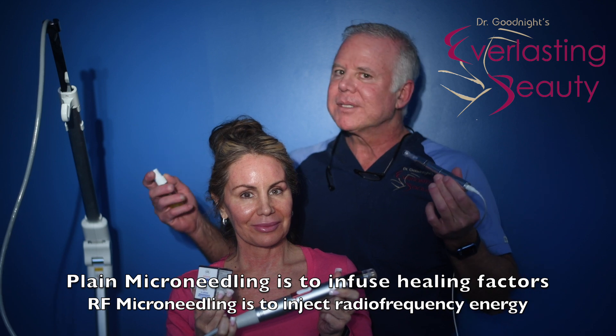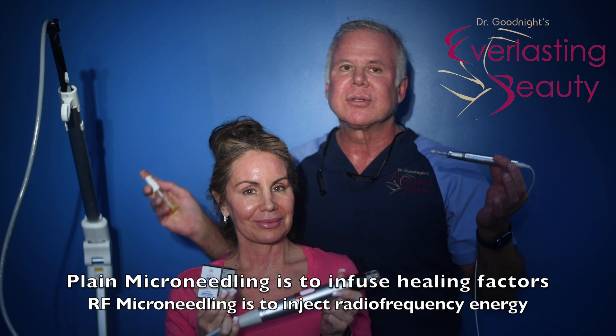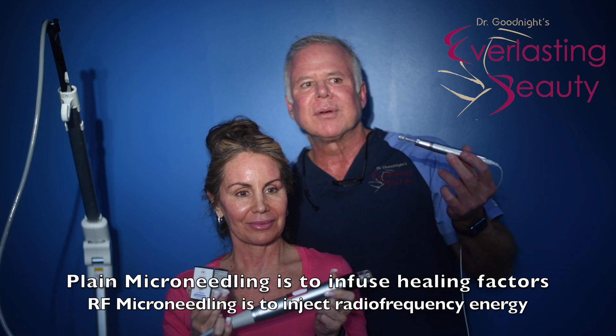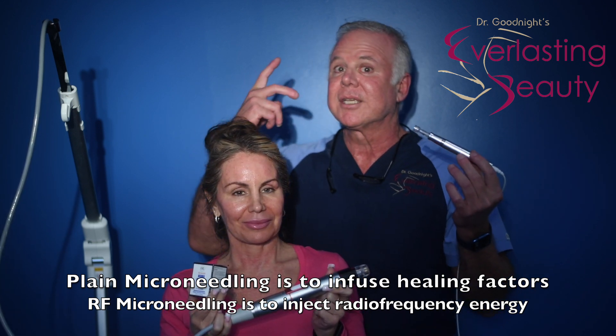The whole purpose of the needle holes is to infuse things like stem cell peptides or PRP. You spray it on, it goes through the needle holes and makes your face porous. You tend to do this as a series because with just one session you don't get too many results. You can often do it monthly — maybe get a year younger each time, depending on how you respond or what kind of things you put on topically.